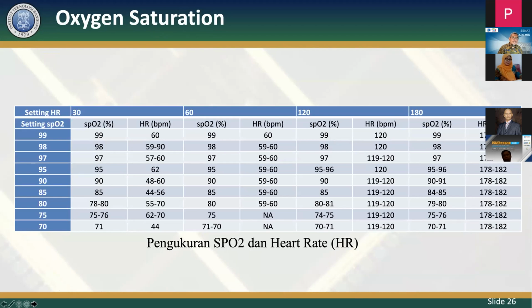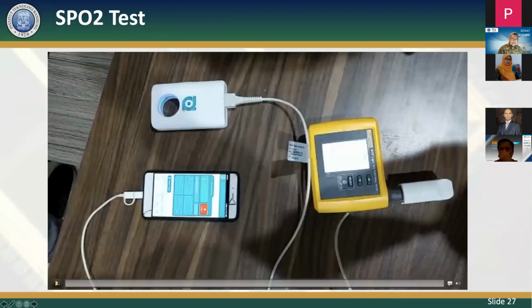So this oxygen saturation, we also measured and compared with the other commercial products and also their heart rate. You can see that the difference is not so much.